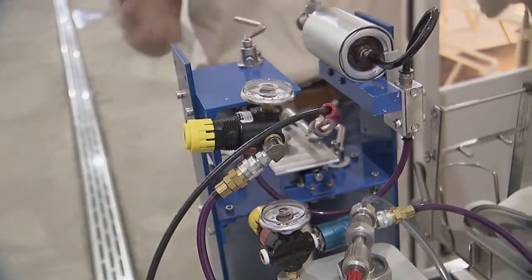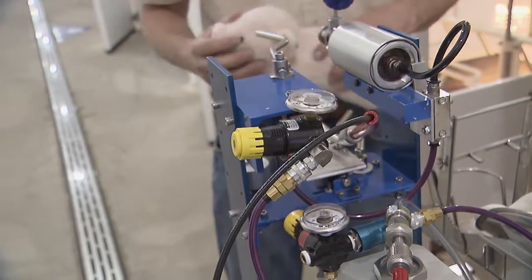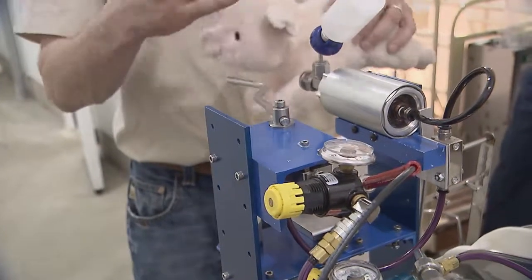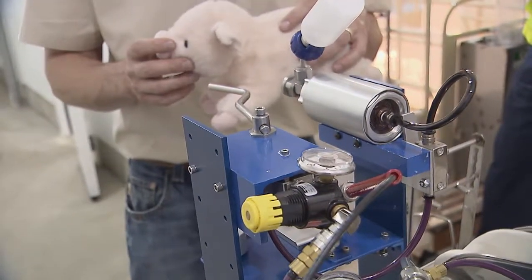The system we have here today on this processing cart for baby pigs is considered hands-free, where you do not have to hold the injector. You have both hands free to hold the pig, and you bring the pig up against the needle-free injector, and it releases the vaccine on contact.